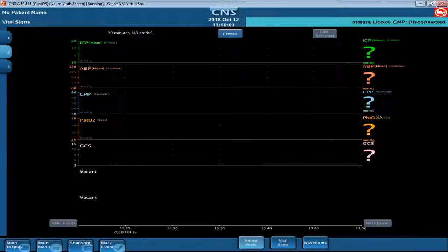We're really open. One of the things I would like to discuss next time, I think, is some of the operational buttons down on the bottom, the marking events, the taking snapshots, and those types of things. I think those are all super practical day-to-day uses. So yeah, that would be great.